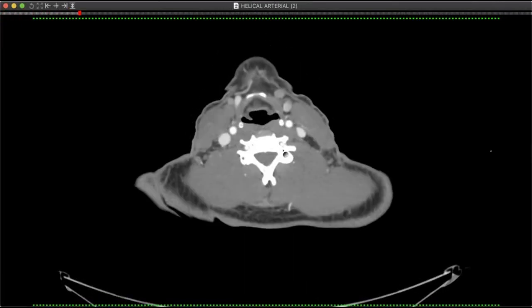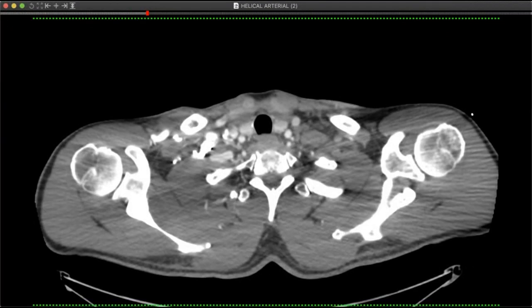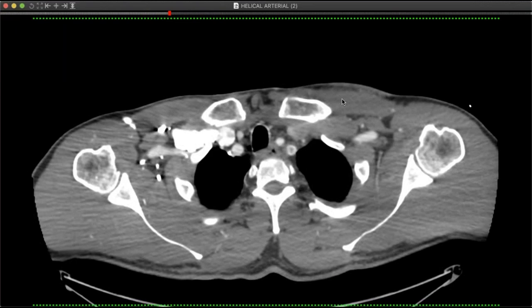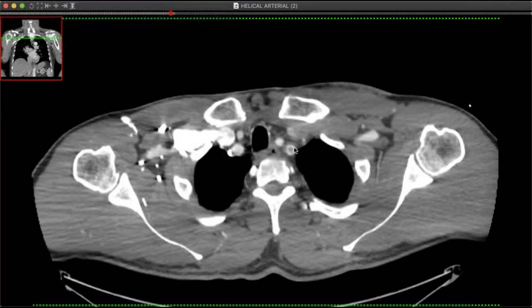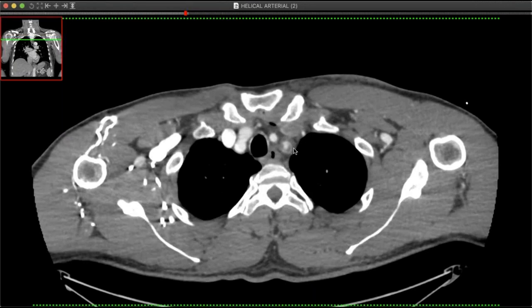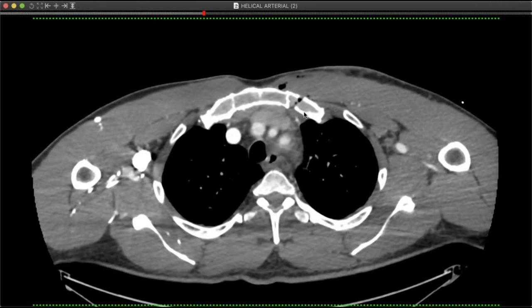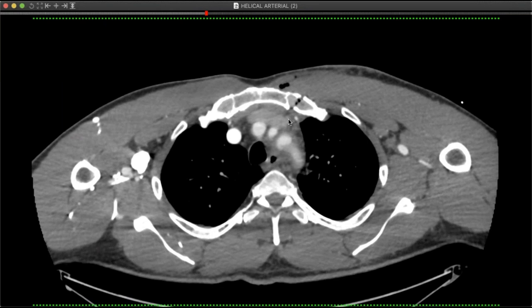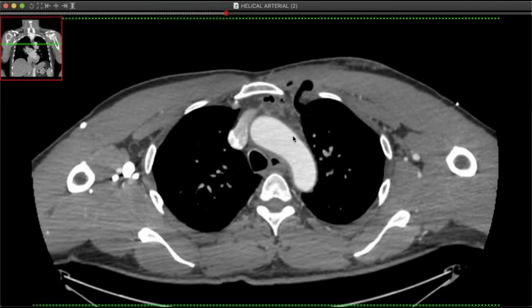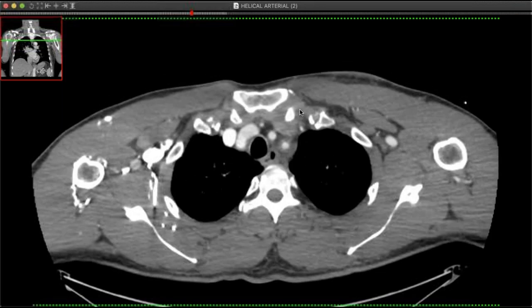And this is kind of a cool injury. It's not one I recall seeing in this location. You'll see there's some swelling up in that area, but look at the left subclavian artery filling defect in it. And then there's what looks like a mural abnormality going down to the arch. There's gas, and you can see the fracture, but the fracture is through the rib cartilage that had subsequently ossified. And then there's a lung hernia associated with it as well, but sort of an isolated subclavian artery.